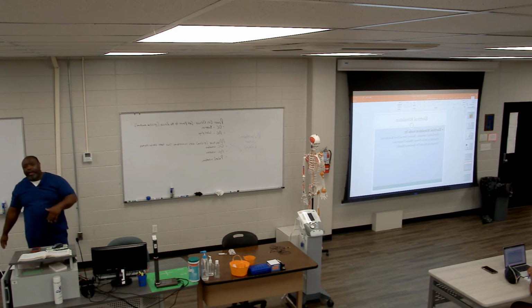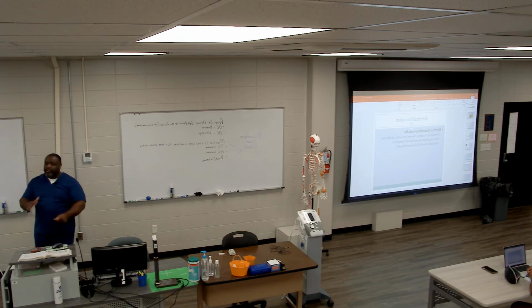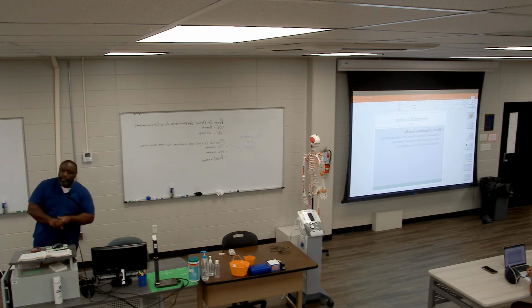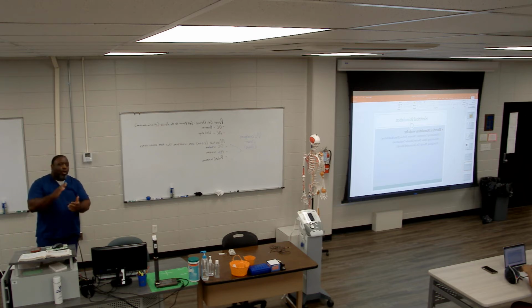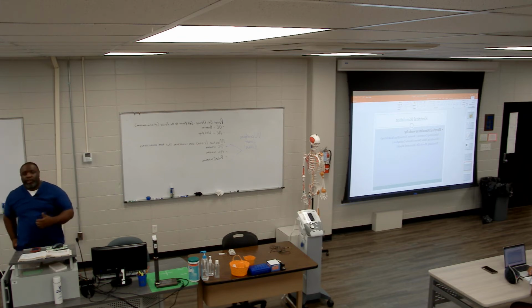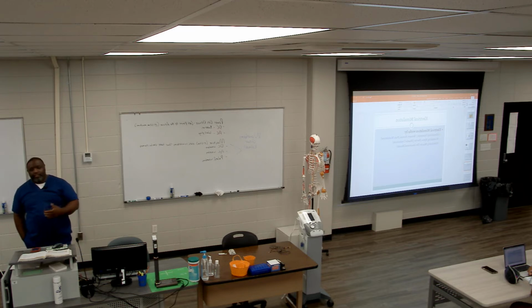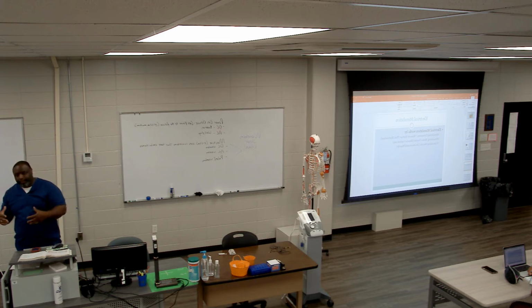And we'll talk about how that mechanism works. I remember hearing Ms. Jonna mentioning it to y'all, and she's gone through it as well, dealing with the gate control theory of pain, Melzack and Wall. We'll dive even deeper into that theory. So I'm trying to stimulate cutaneous nerves or sensory nerves so that I can reduce pain.